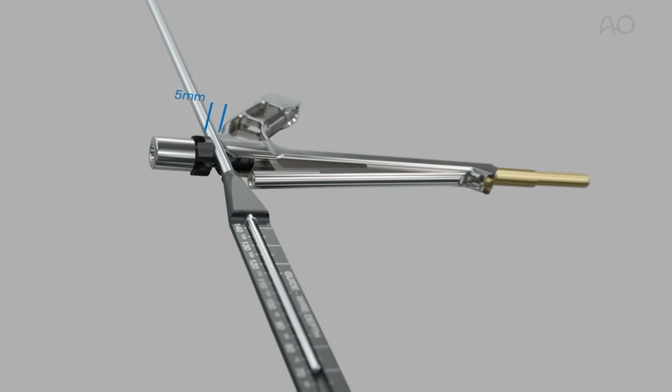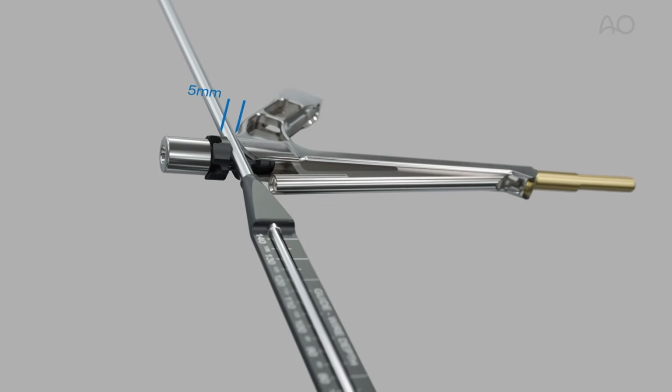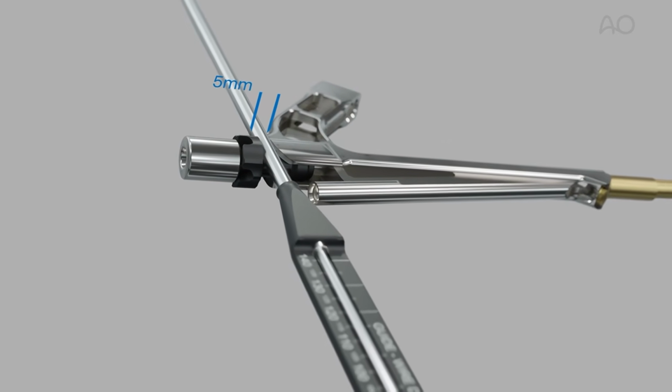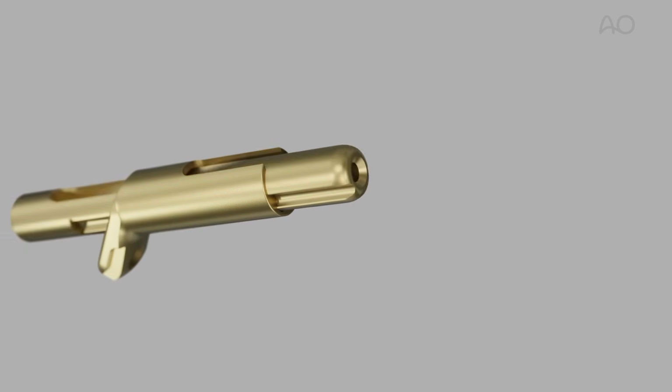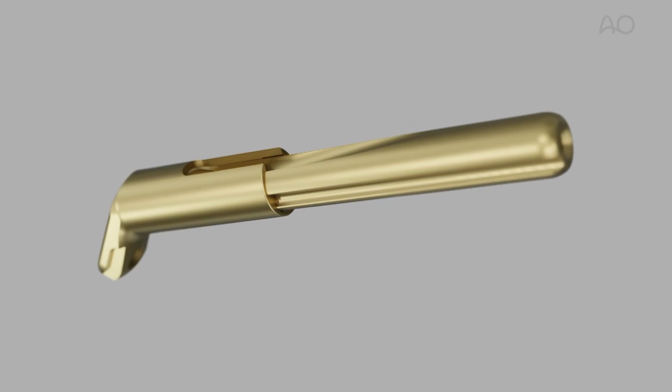The shaft of the direct measuring device can be used to confirm a distance of at least 5 mm. The 5 mm longer bolt is inserted into the plate and attached to the insertion instruments as earlier described.